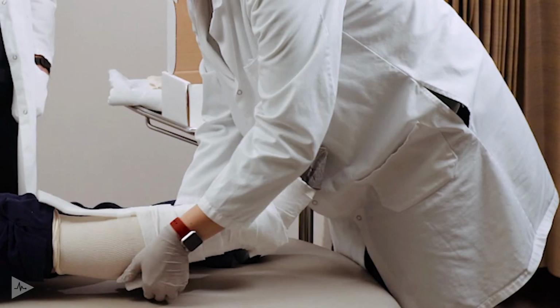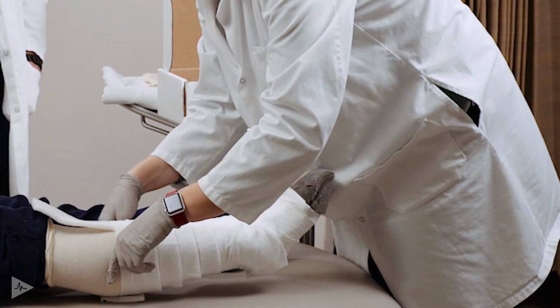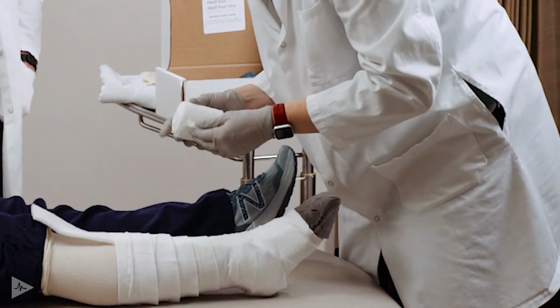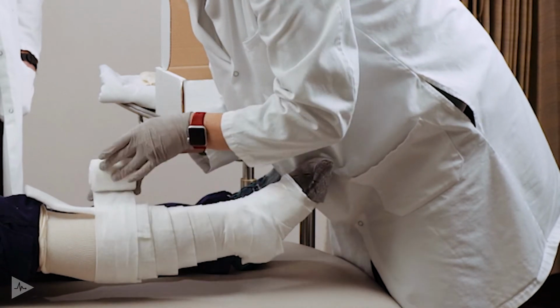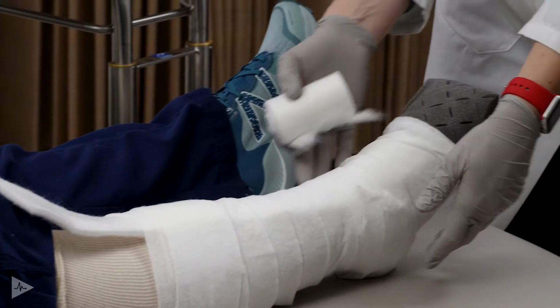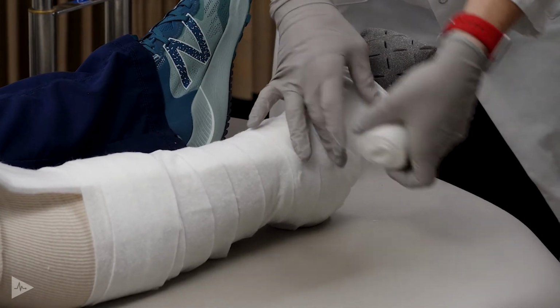And this is the piece where I like to remind myself where that cast is going to stop. So again, finding the widest part of the calf. So I'm going to probably stop my cast about here on this patient. So I'll add 1 more roll here just so I have that visual marker for me going forward as to how high I want to bring that cast. In a particularly bony patient, you can always add more padding through the ankle and foot as needed, but you are not required to use all of the padding in the casting kit.